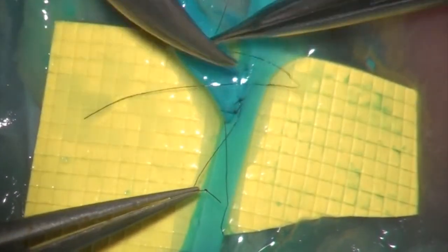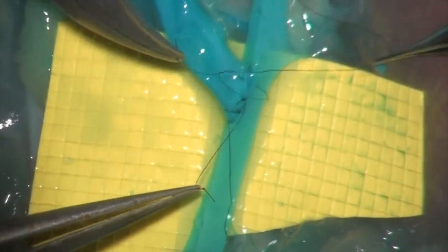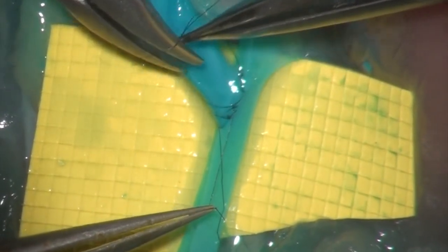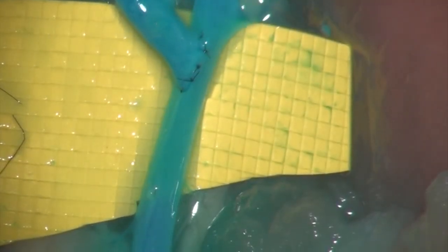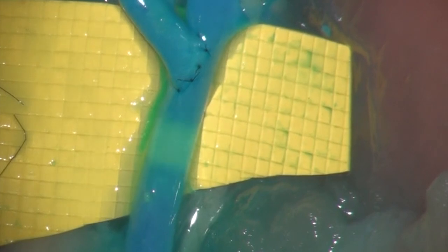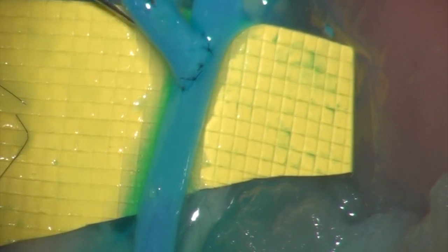When your bites are taken and before you tie down your first knot, differential tension on the ends of the sutures will ensure perfect approximation of the vessel walls. When the anastomosis is complete in the blue blood chicken thigh model, methylene blue dyed saline is then run through the anastomosis to check for leaks and patency.